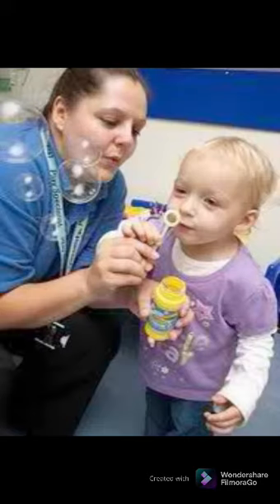Procedure for pediatric venipuncture. Review and accession test requests. Approach, identify, and prepare patient. Verify diet restrictions and latex sensitivity from guardian. Sanitize your hands. Then you explain the procedure to the child.